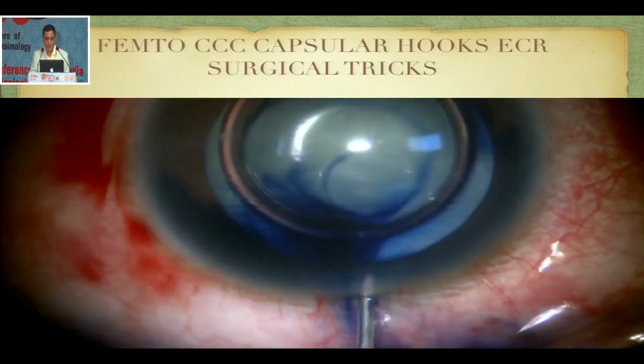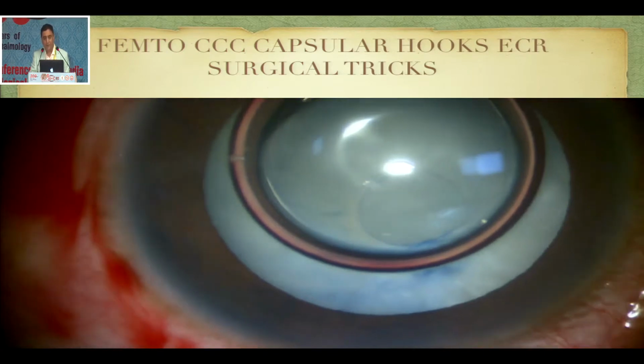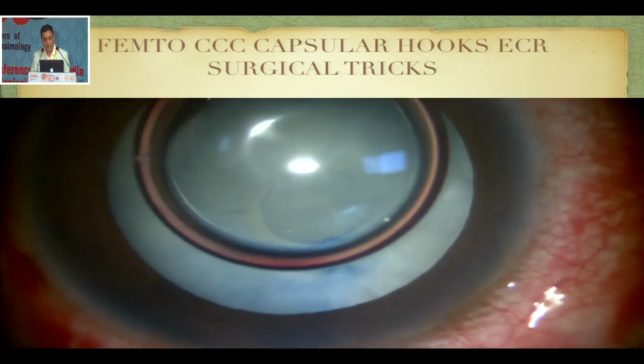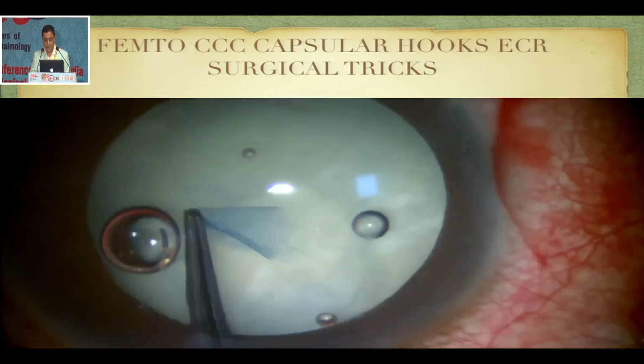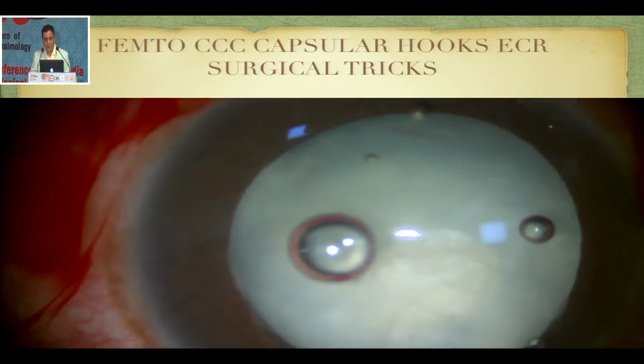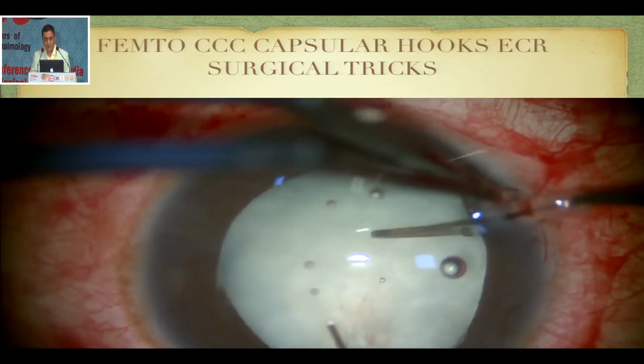I've done a femtorhexis here, but you can see the size of the rhexis. I was very scared, A, because it was hypermature, and B, because it was a large area of subluxation. Doesn't matter, I stained it. It's a soft cataract, and I removed that area. Go ahead and make your rhexis a little large. Once that is done, the whole subluxation is inferior.